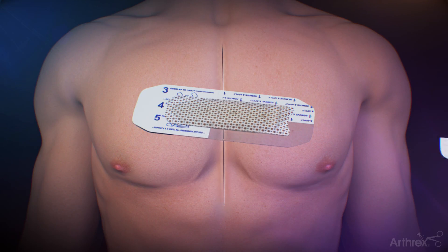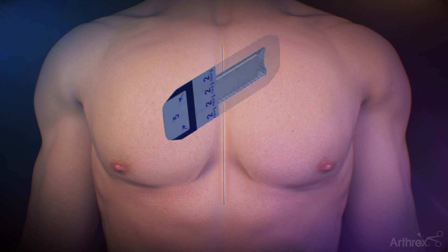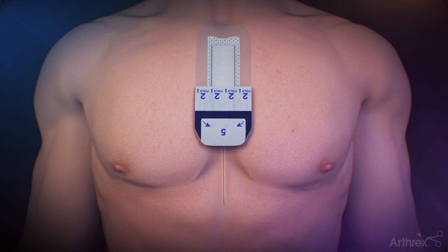Remove the liners labeled 1 and place on top of the proximal portion of the incision. Make sure to press down gently on the dressing to ensure direct contact of the microcell battery dot matrix with the incision.